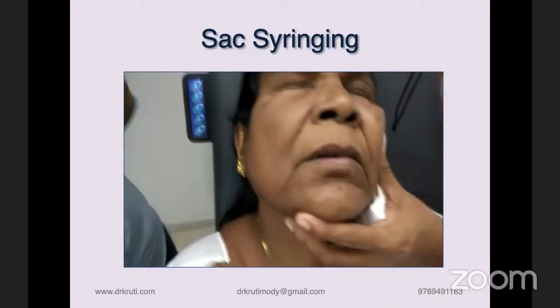The other advantage of using a canalicular cannula is that you know how deep you are going. So at the same time, you are able to evaluate the site of obstruction. Am I not able to go beyond 2 millimeters, am I going till 4 millimeters, or am I actually crossing the common canaliculus? So at the same time, you are evaluating your canalicular system as well, and you are checking for your NLD. Okay.